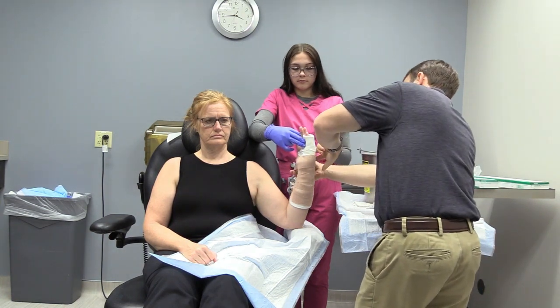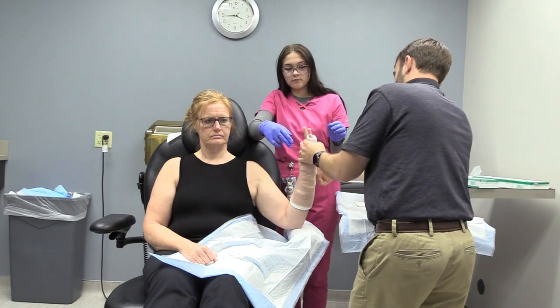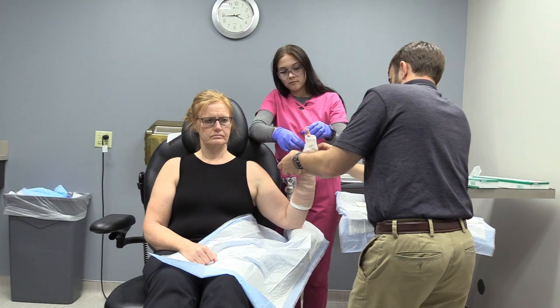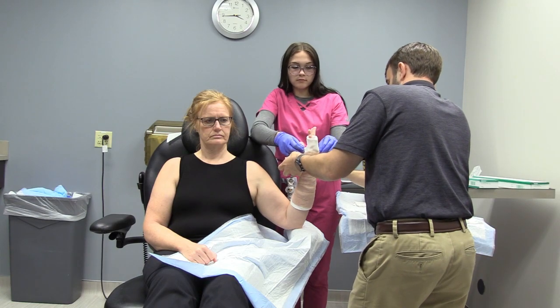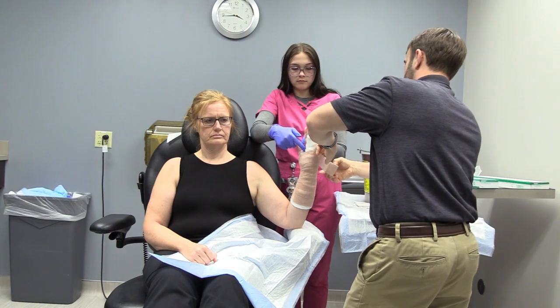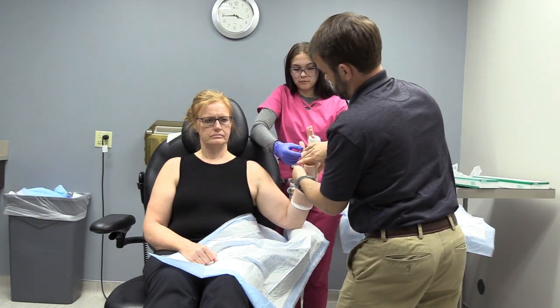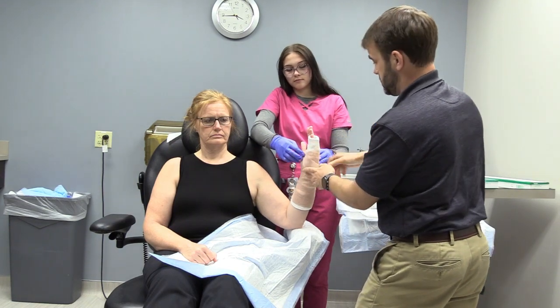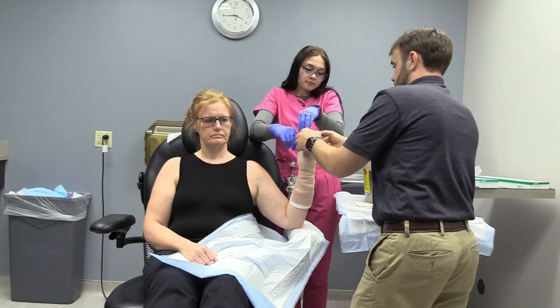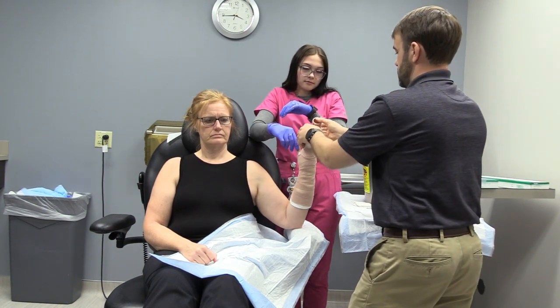And then around the thumb, you have to get a little bit creative to make sure they're secured without being too restrictive. So I usually will run it up through here and then turn it as I go through. Just a half turn. You can always do another one if you're feeling like you need to cover more of it. Otherwise you can just bring it up across here.